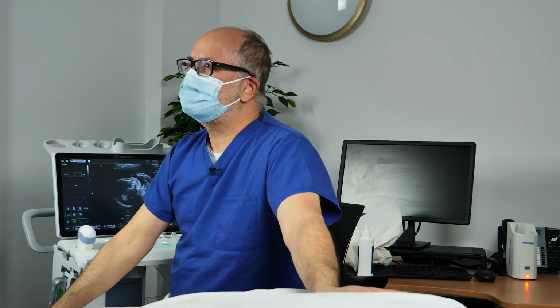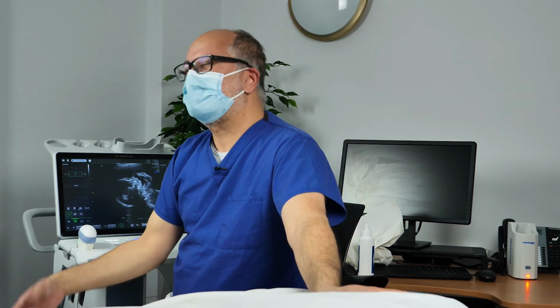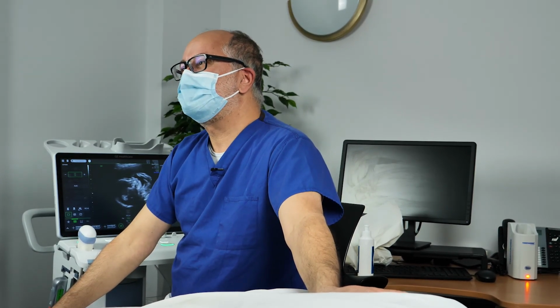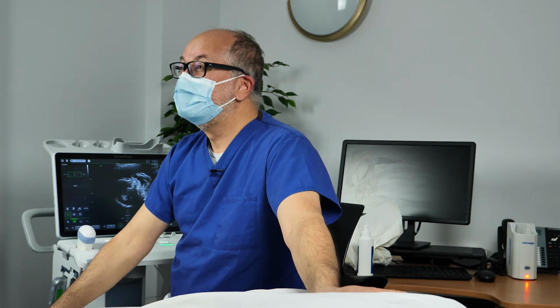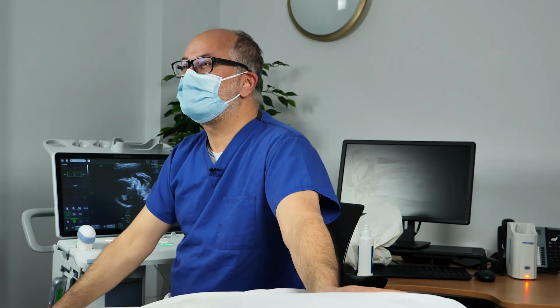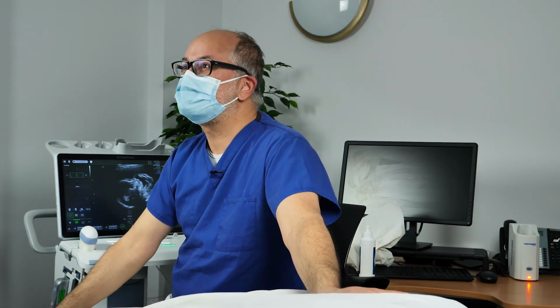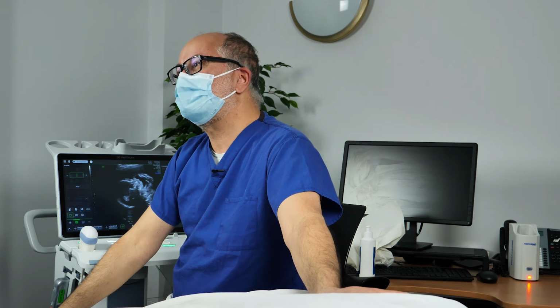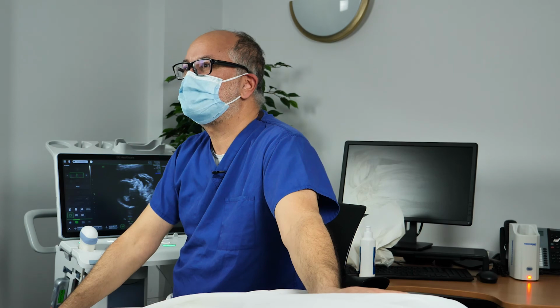And I don't think you need the most expensive machines necessarily, but the people need to know how to drive them really well. And the idea of this is to help people who perhaps are still not the most experienced drivers with some technology in the same way that you do in your car. You've got systems that help you, right? Whether it be your satellite navigation or your lane assist and all these things. It's kind of in the same vein of assistive technologies that will hopefully make accidents less likely.